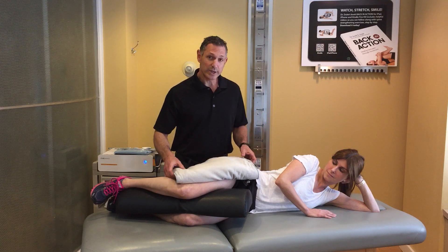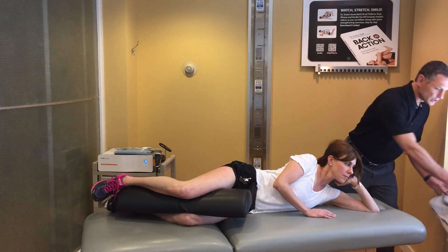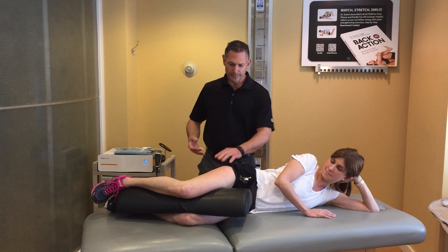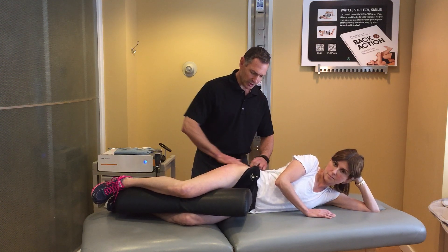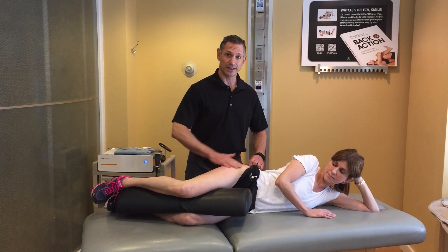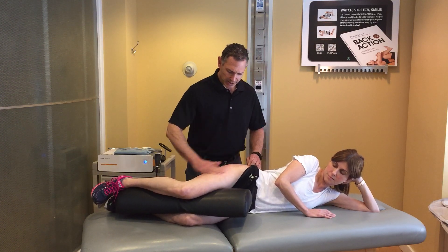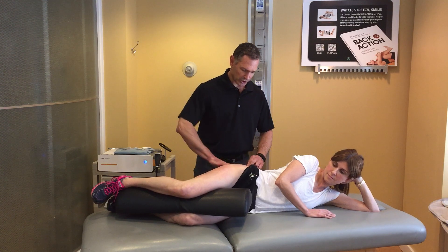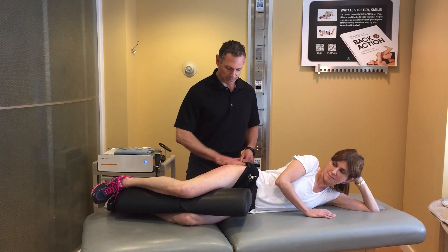First, what we do is heat up the tissue, which we've been doing, so it gets nice circulation. Then I like to pinpoint the target area, so we're not just applying EPAT blindly, because you can't tell where there's scar tissue even if you try to visualize it — you can only really feel it.